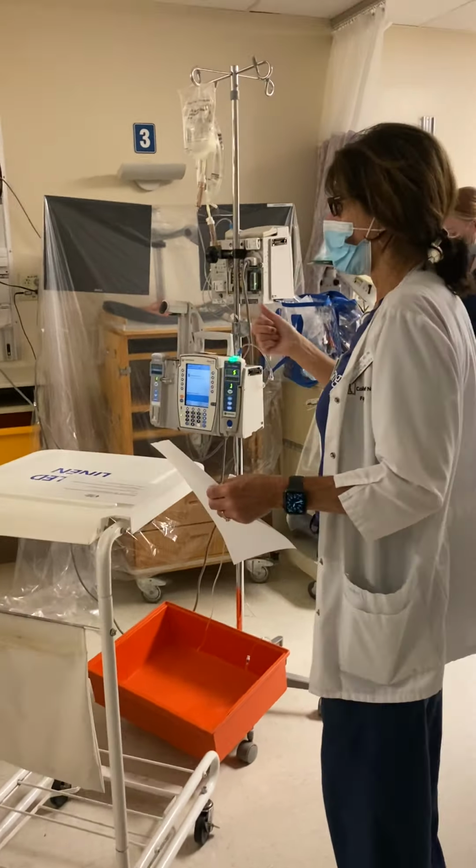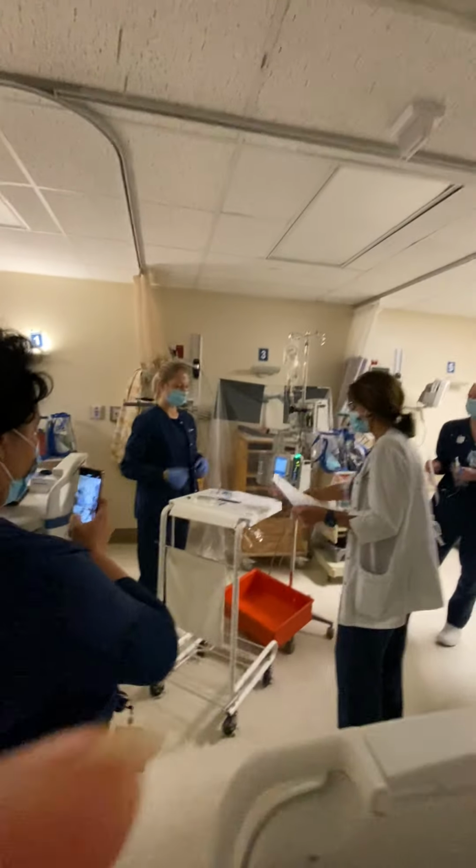Okay, perfect. And do you have your MAR? Okay, perfect. Because again, in real life, obviously, it's gonna pop up on the computer when you barcode, but we don't have a computer to pop up on. So again, just always remember your MAR.